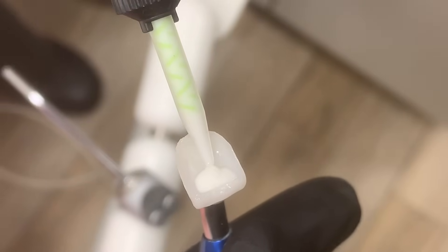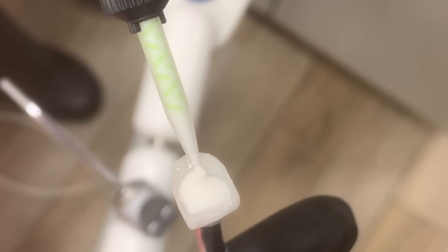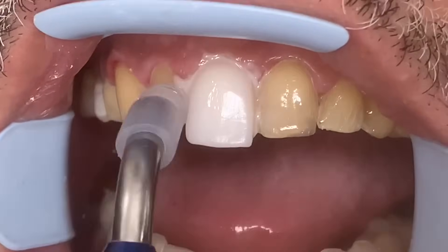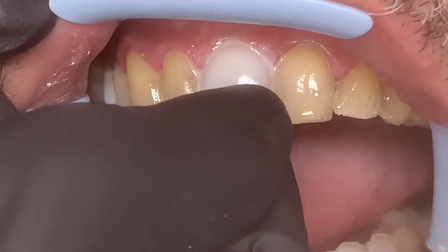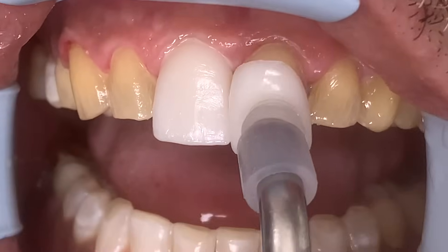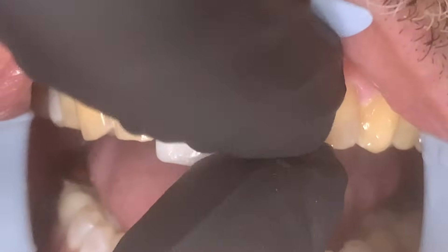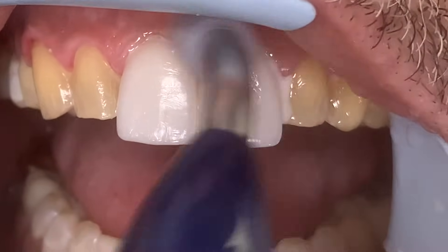When we load it, we don't lift up the tip. We load the entire veneer — we don't fill it all the way up with the material — and we're going to seat it. I love this little gadget, it's awesome. The first veneer is now seated and we're going to tack it down for just a few seconds. Now we're going to place the other central on. You can see these are just beautiful, and again we're going to use this device to clean up all the excess.